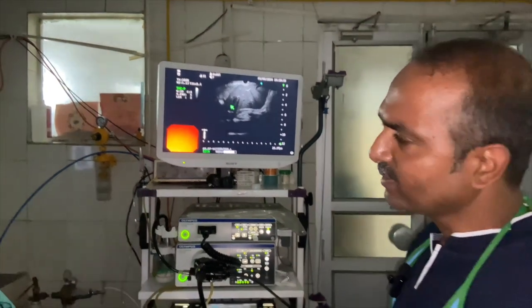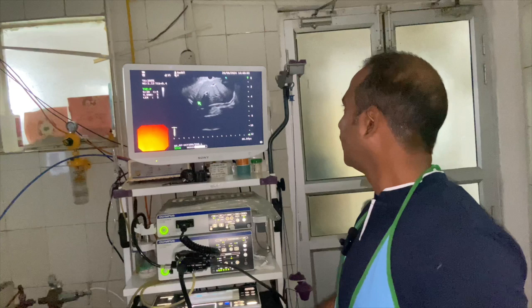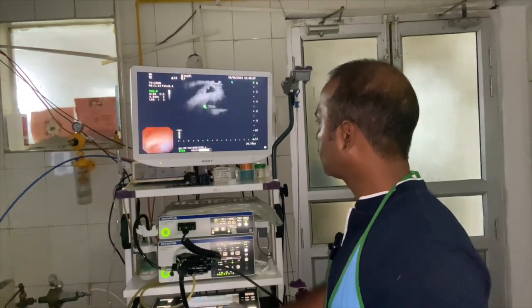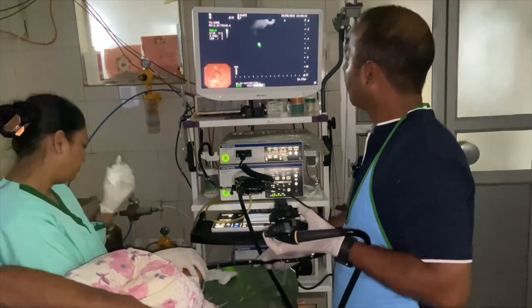So remaining segments like the segment 6, segment 5, they are better defined from the duodenal aspect. So we will move the scope into the duodenum.